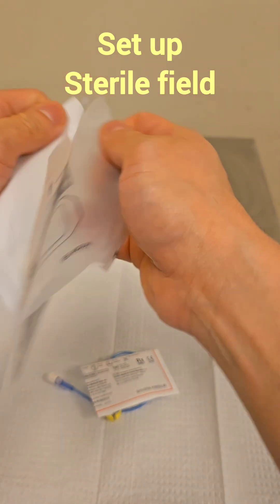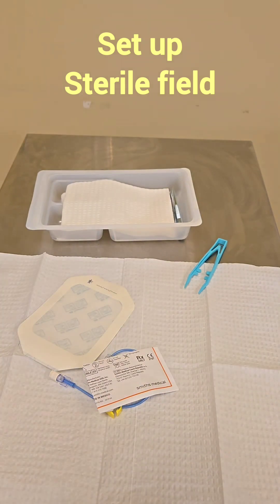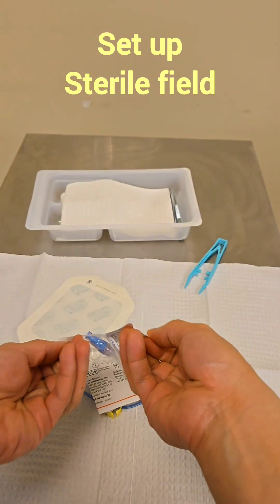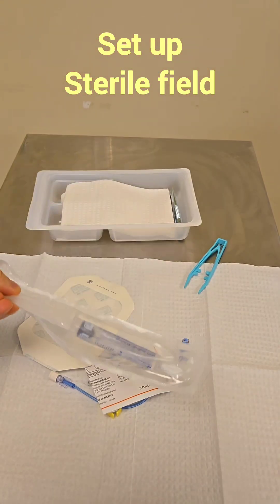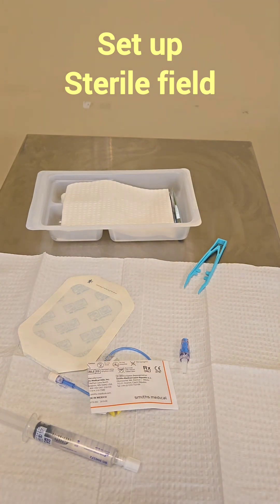Next we're going to drop in our dressing — open it up, drop it in — then our blue cap, and both of our sterile saline flushes, one and then the last one.